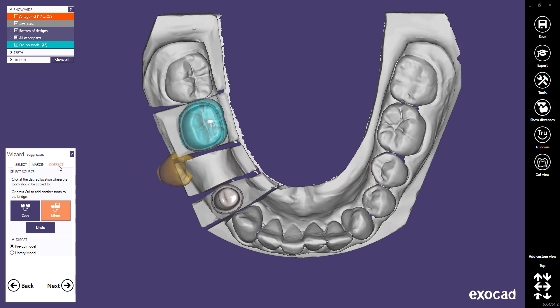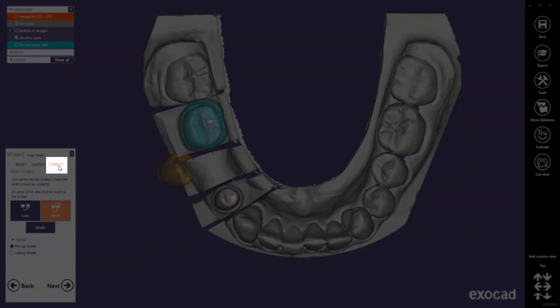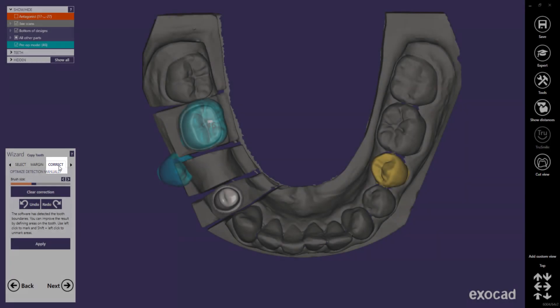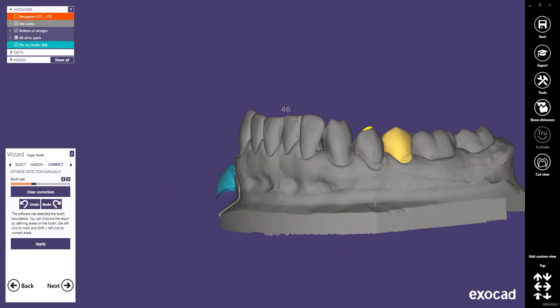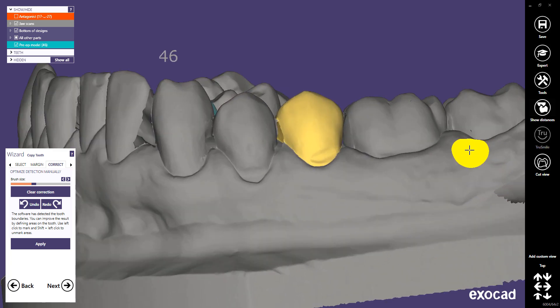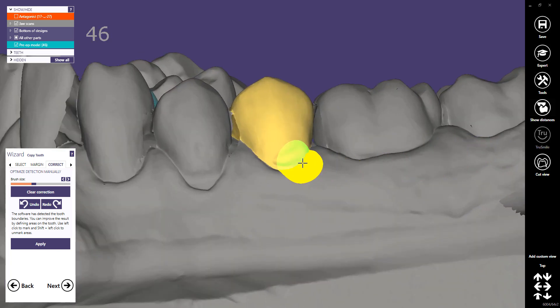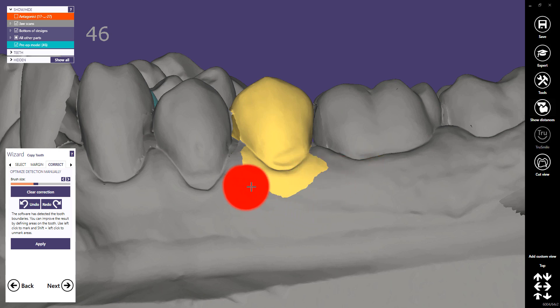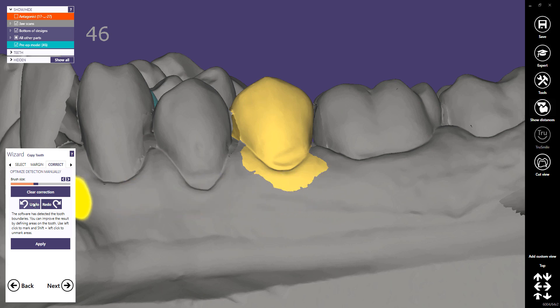In some rare cases, the one-click tooth detection may not work. If this happens, you can use the Correct tab to manually define which parts of the scan belong to a certain tooth. You can adjust the brush size with Shift and the mouse wheel, or with the slider in the wizard. Paint the area with the left mouse button, and use Shift and the left mouse button to toggle and delete brushed parts. You can also undo your actions or clear the marked area.